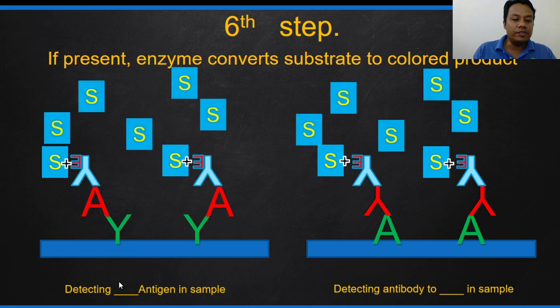This means that this patient is positive for having the specific antigen in their blood, for example, the COVID-19 virus particles in the patient's blood, or the patient has antibodies produced. I mean, probably they are immune to the antigen. For example, COVID-19, they have the antibody against COVID-19 here. So these conjugated enzyme antibodies act as an indicator.